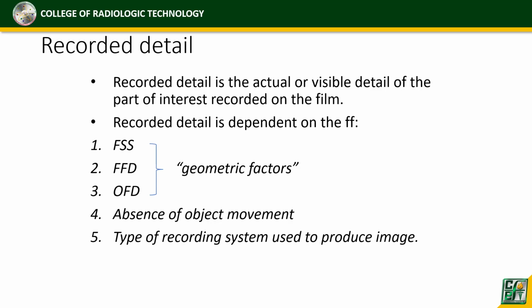FFD, focal film distance. OFD, object to film distance. FSS, focal spot size ba? Sige, mamaya tingnan natin kung ano yung FSS na yan, ha?